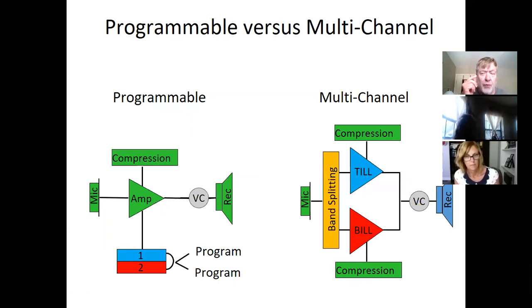This means that you've got it. You've programmed the hearing aid on the software. Maybe you used NAL, maybe you used DSL, whatever fitting method you used.